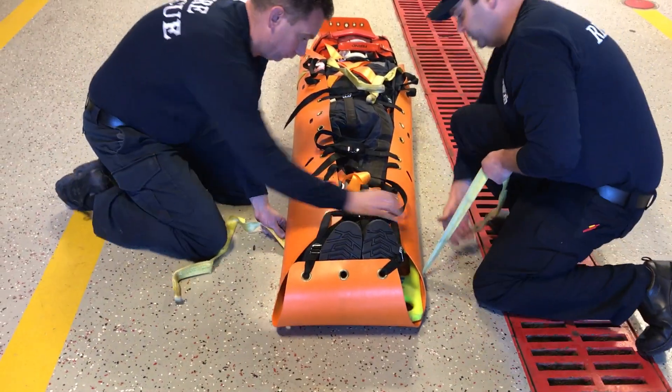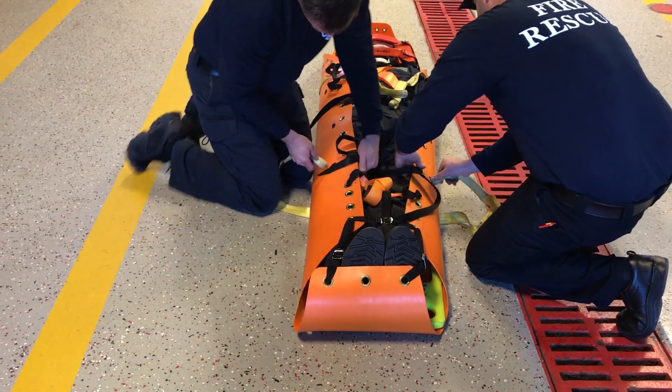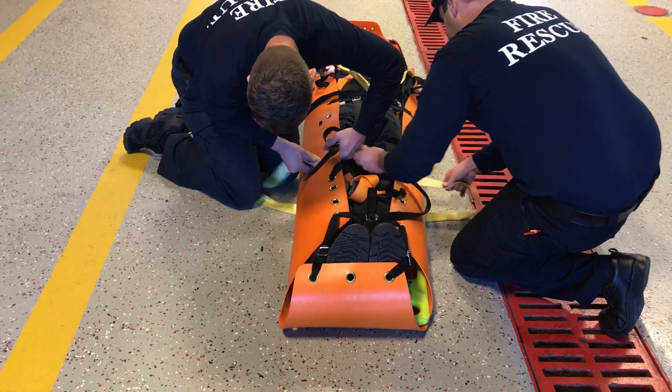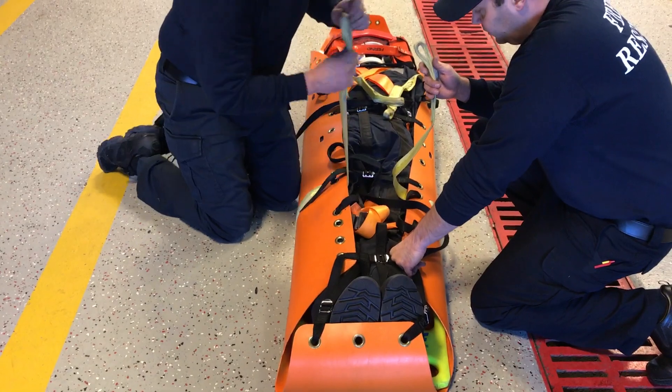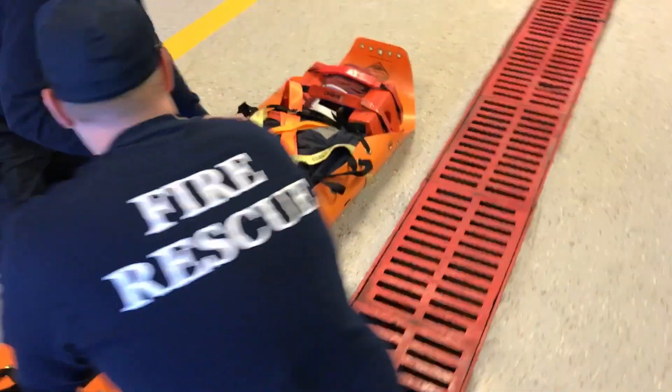If space is limited and you're not able to lift the patient to get the strap underneath, what you can do is kind of feed it under and then see-saw it back and forth to get the strap in place. Now we have both straps in place.